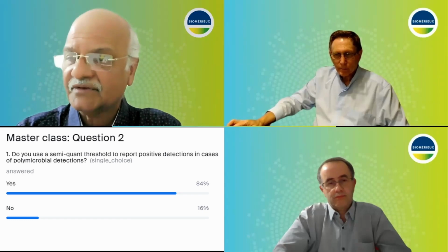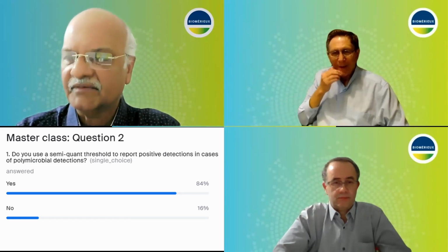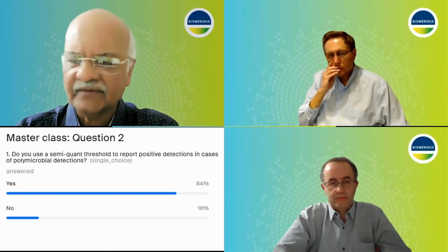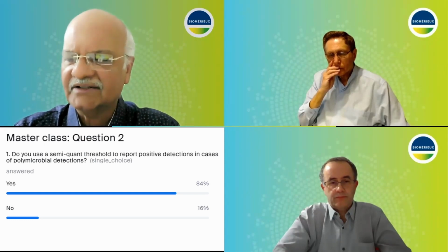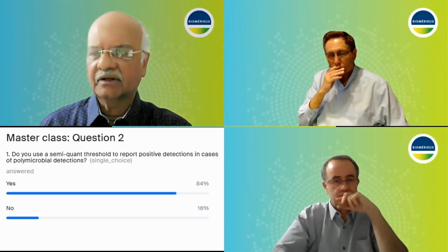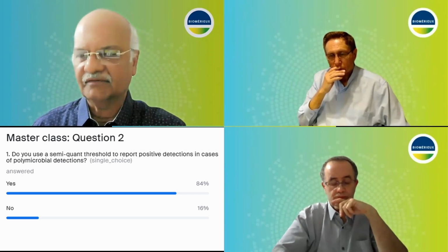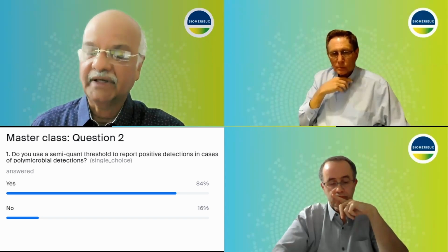Sometimes it's even said that if you find intracellular bacteria, it's certainly very important. Capsulated strep pneumo and such things can easily be seen, and if they form the majority of the bugs on the slide, obviously that is the true pathogen which we can't afford not to pay attention to.